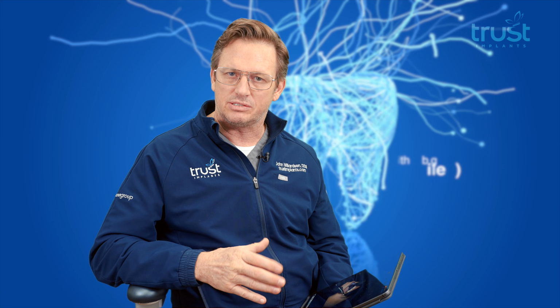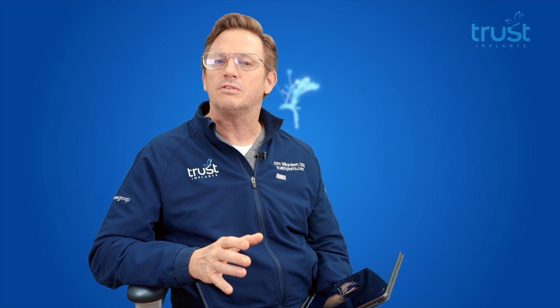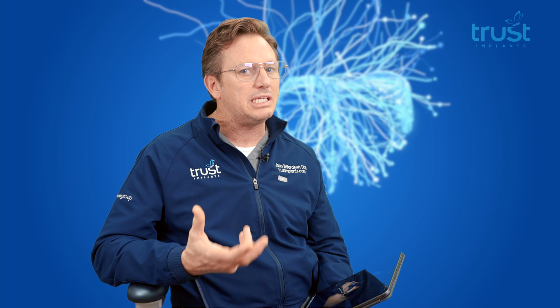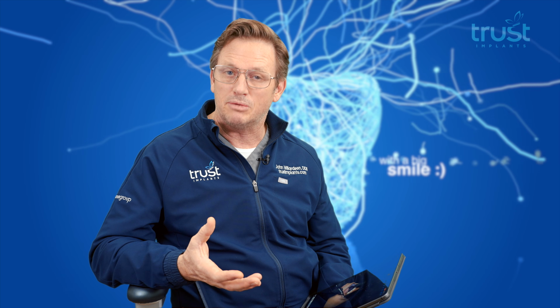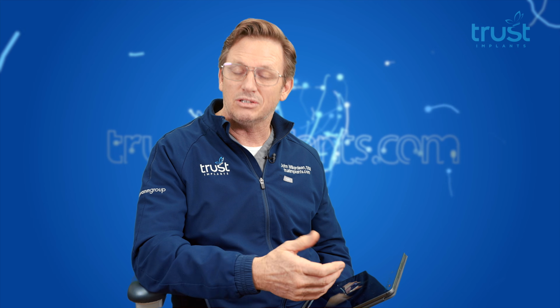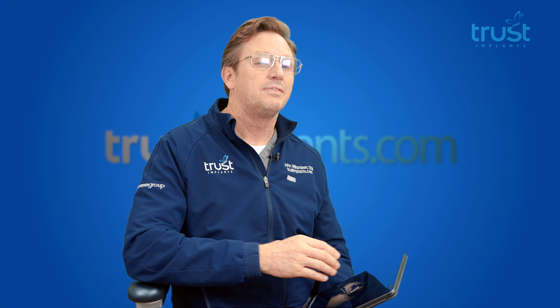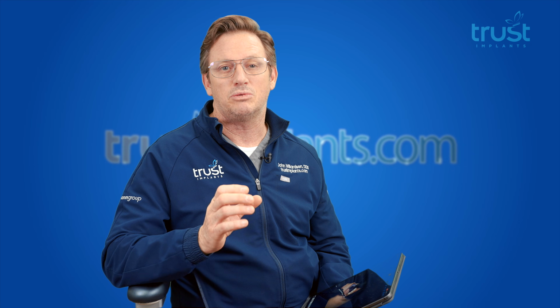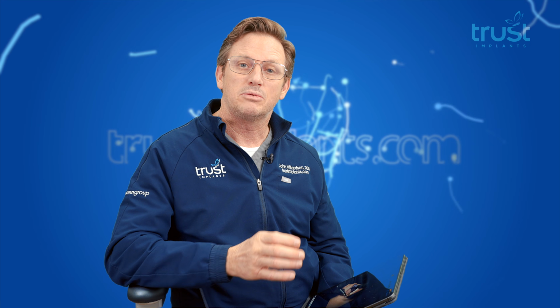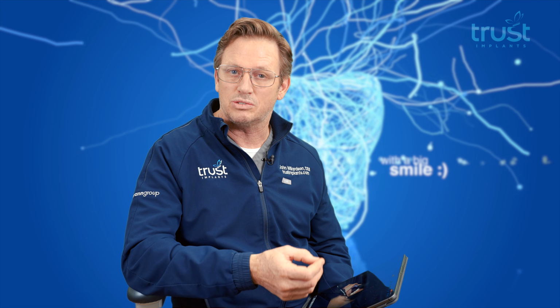I'd like to discuss a procedure that I get a lot of questions about from patients and also other doctors. It's the question of immediate placement of the implant. Do we pull the tooth, bone graft, and let it heal? Do we pull the tooth, graft, and place an implant? And the third option would be, do we pull the tooth, bone graft, place the implant, and immediately load the case, or put the tooth on the implant?